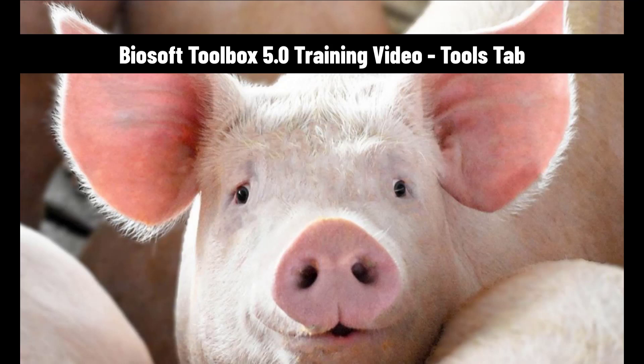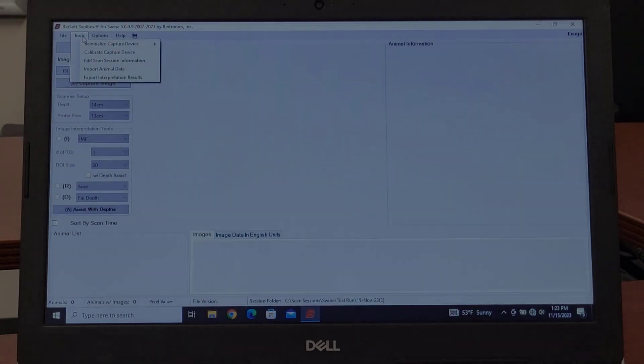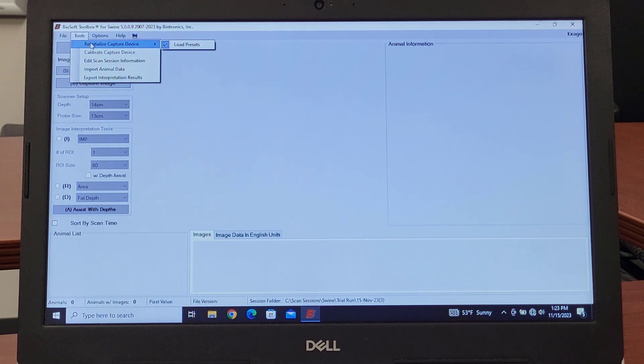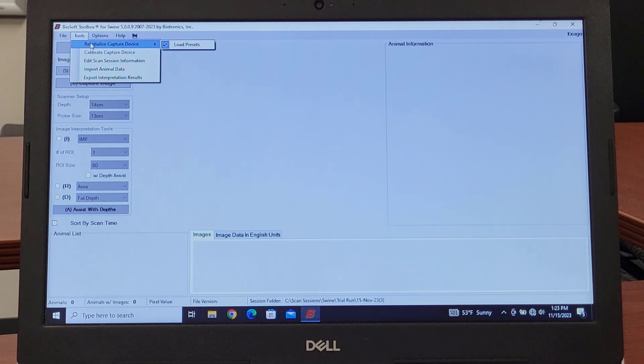This session we're going to be looking at the Tools tab and what's available on the Tools tab. Reinitialize capture device: if for some reason the connection gets loose, the ultrasound gets turned off and you plug it back in, it doesn't want to start streaming to your computer.